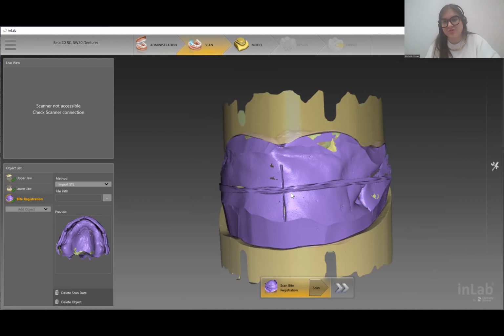The only difference being that you're still going to take traditional records that your patients are familiar with. Now, if you want to just prime scan, absolutely not a problem. You're still going to utilize it in a hybrid method. What I mean by that is you will still need to take traditional impressions, like final impressions, whether it's a wash impression inside an existing denture, or whether you're actually taking a full final impression in a custom tray, pouring it up into stone. At that point in time, your stone model can still be utilized with your prime scan as a handheld scanner. Okay, so that is worth mentioning, that you can get by with one or the other. You don't have to have both options to go digital. You really can have one or the other at this point in time.